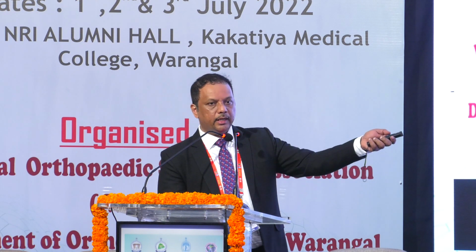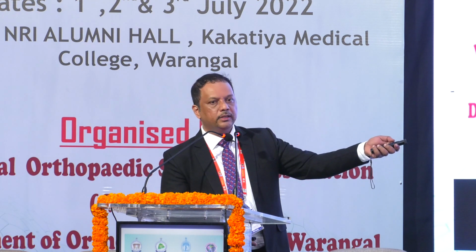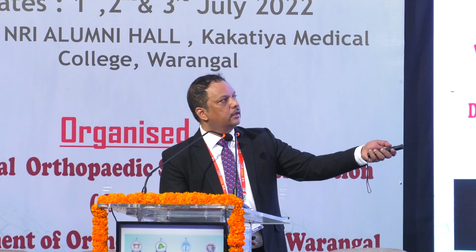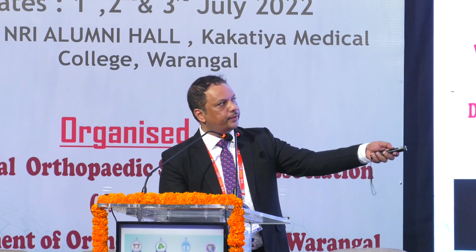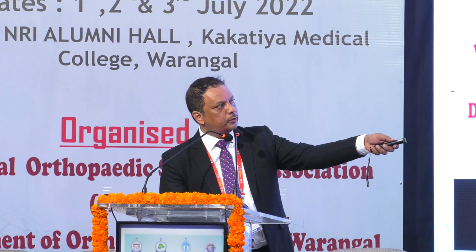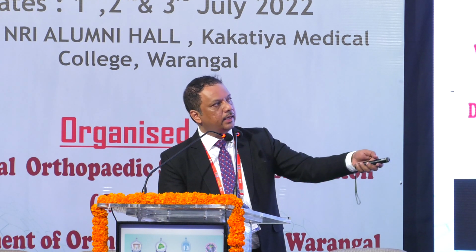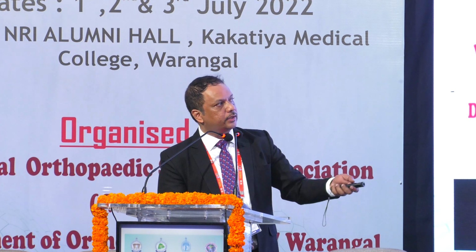Sometimes you have a dedicated plate here at this point. Okay. So that is the lunate facet fragment, and there are plates designed for this. These are the hook plates. The tines of the hook plates just go subchondral at this point. Okay. And you can place that separately at this. Right, and that's the fixation.